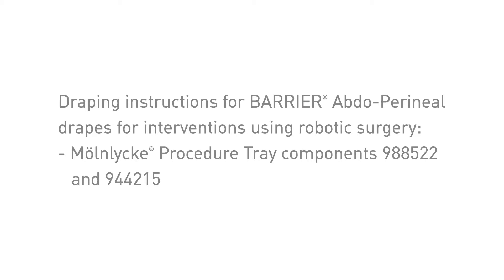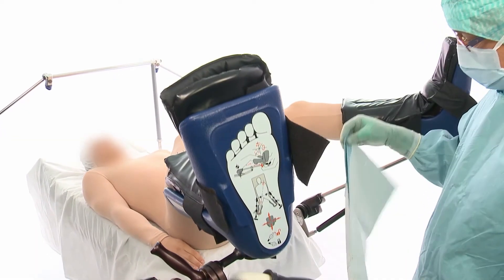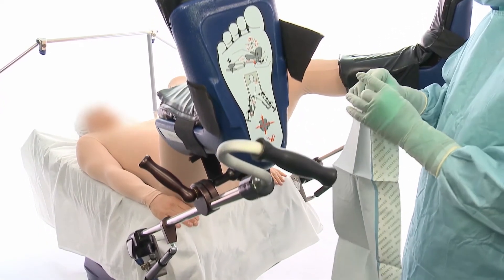Draping instruction for the barrier drape for abdo-perineal interventions using robotic surgery from Menlicka HealthCare. To start draping, use an adhesive towel as the underbuttocks drape.